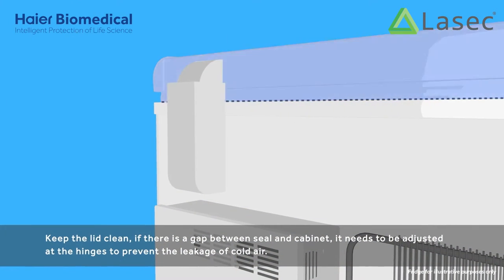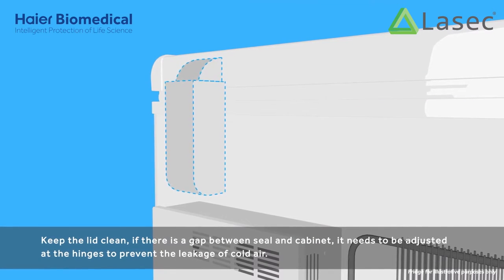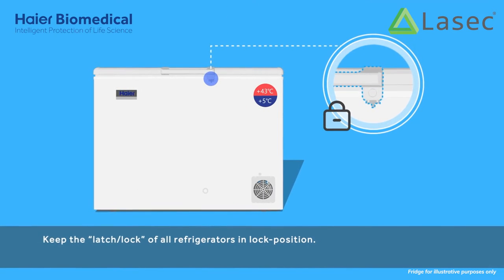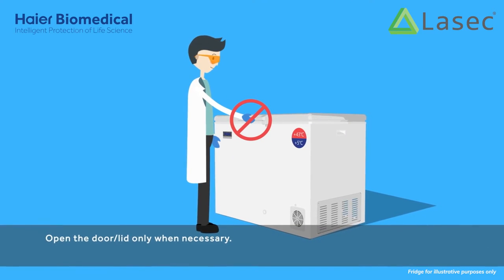Keep the lid clean. If there is a gap between the seal and cabinet, it needs to be adjusted at the hinges to prevent the leakage of cold air. Keep the latch or lock of all refrigerators in the lock position. Open the door or lid only when necessary.